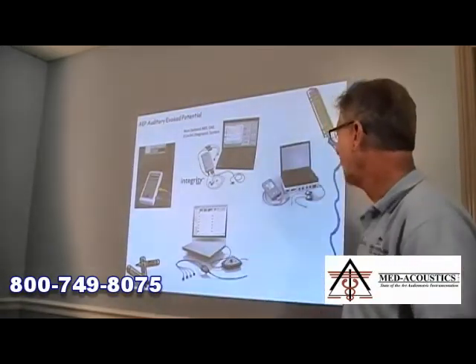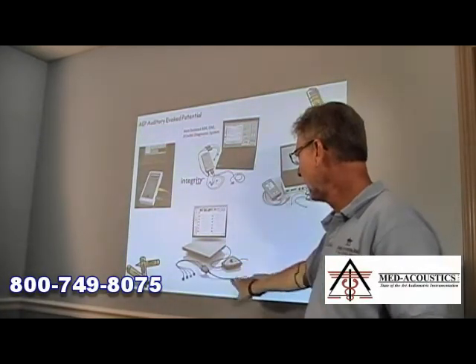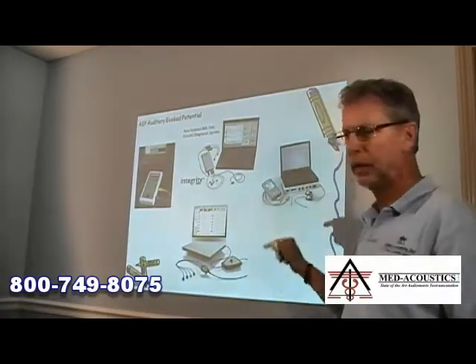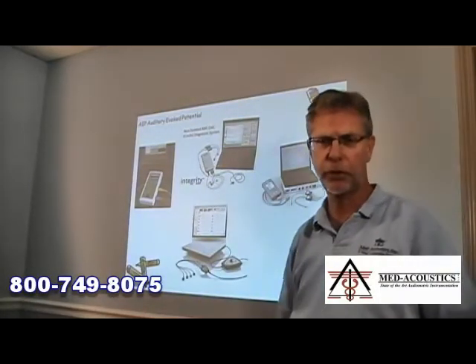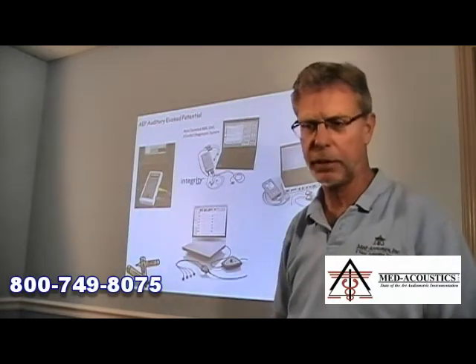Okay, and there is a small and lightweight preamp, and then a patient cable, and the inserts or bone or whatever you use for a stimulus plugs in the back of it.